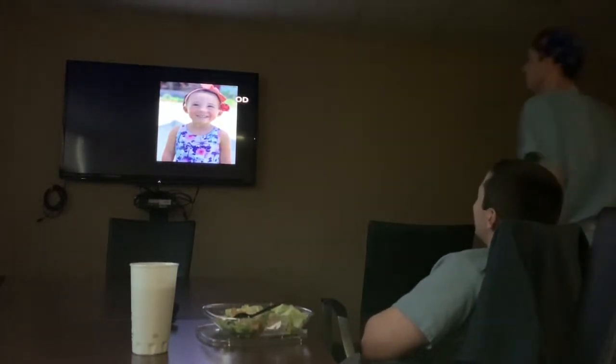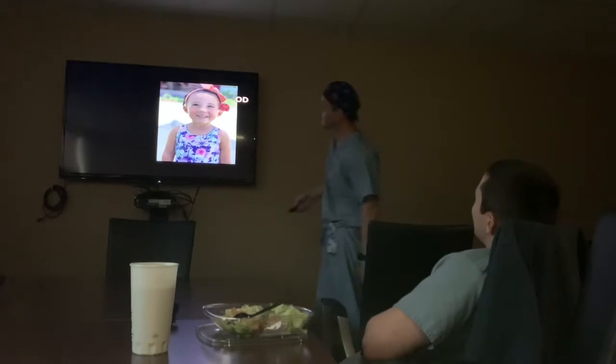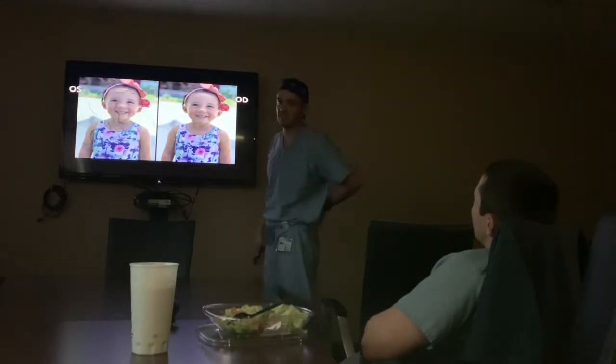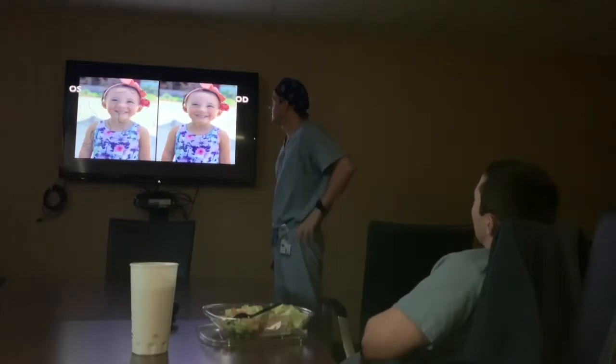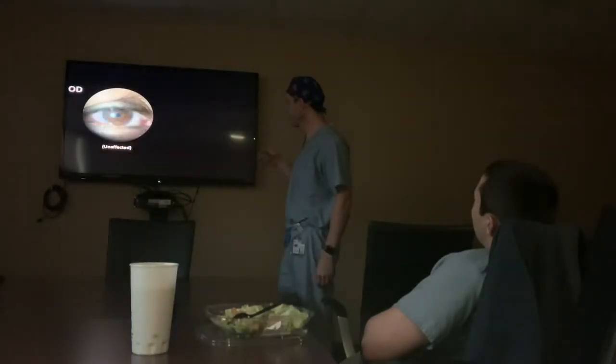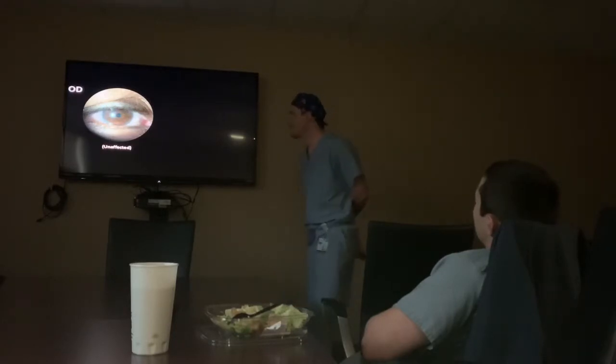This is what they're seeing in the right eye and this is what you're seeing on the left. Chief complaint is floaters or spots. This is the right eye — the cornea looks kind of steamy, there's a poor light reflex, conjunctival injection, and a little bit of ptosis.